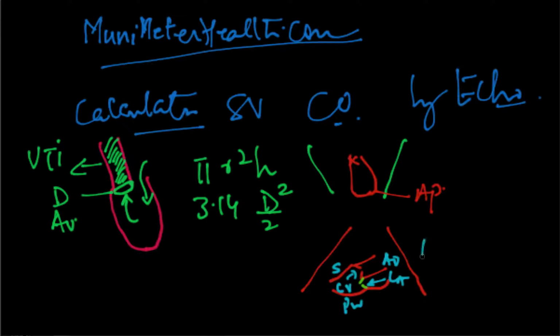Now this is your long axis view, correct? As you see it on the Doppler. So what's happening is that each time the heart empties from the left atrium into the left ventricle, that left ventricle later contracts fully and sends the blood up into the aorta. Now as it's traversing up, you want to take the Doppler.